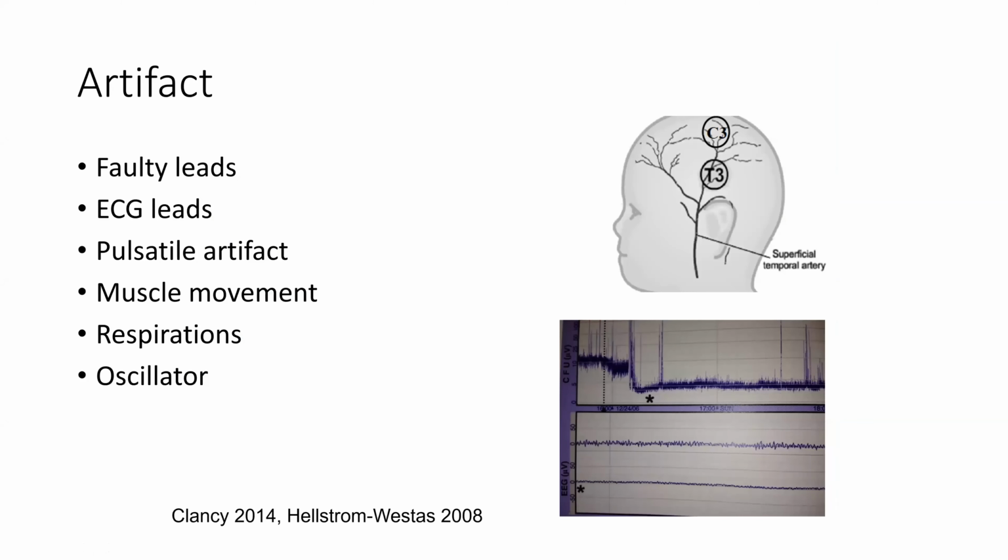And so we want to make sure that we're aware of artifacts, and Greg and Martina are going to share with you some ways that we can identify these artifacts, minimize these artifacts, and make it easier for us to interpret right at the bedside.